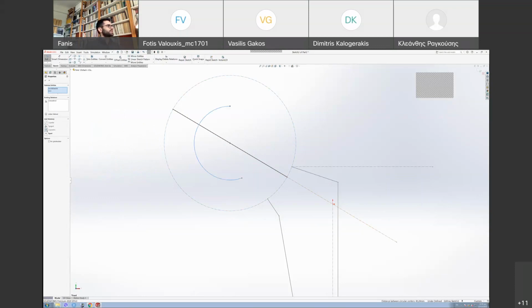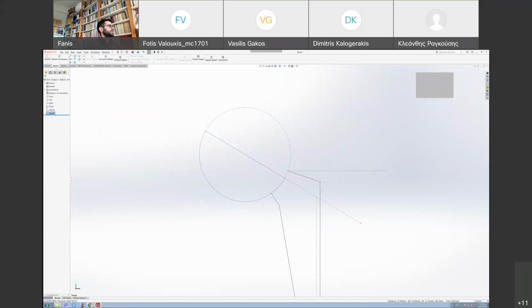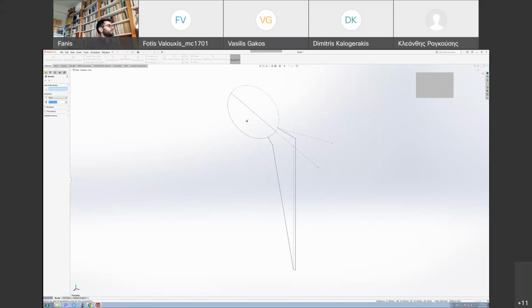Okay, so I'll make this concentric, I'll make this coradial, and I will merge these points. I will merge these points again. So we exit the sketch. We select the sketch, we go to revolve boss base, and hopefully we won't have any problems. Here it asks us for the axis of revolution. For us, this is the axis of revolution. And by this cross section, by revolving around this axis, it's able to create a sphere. Okay.